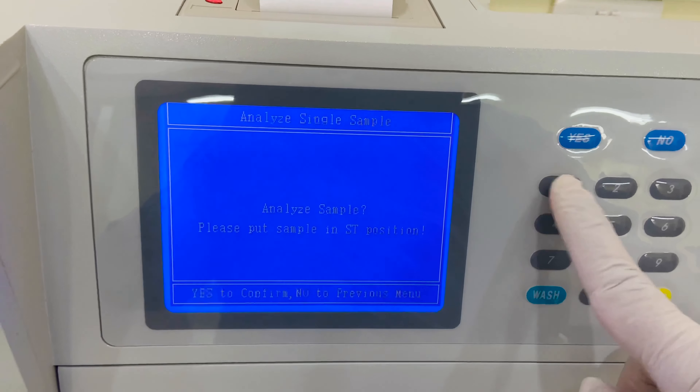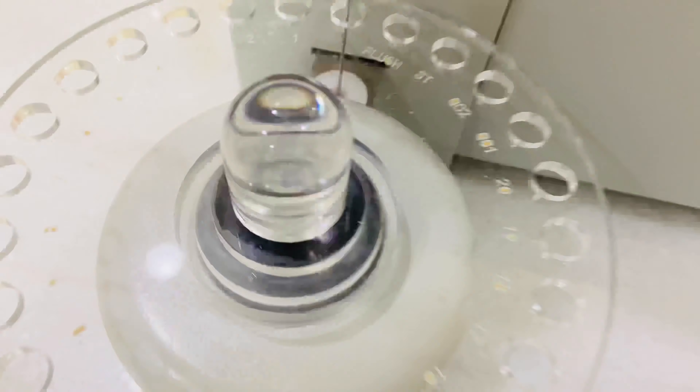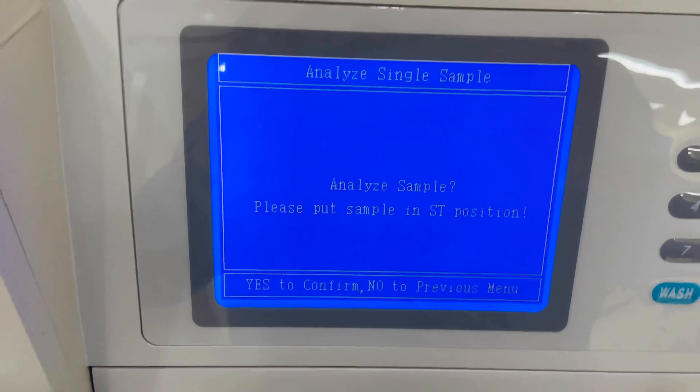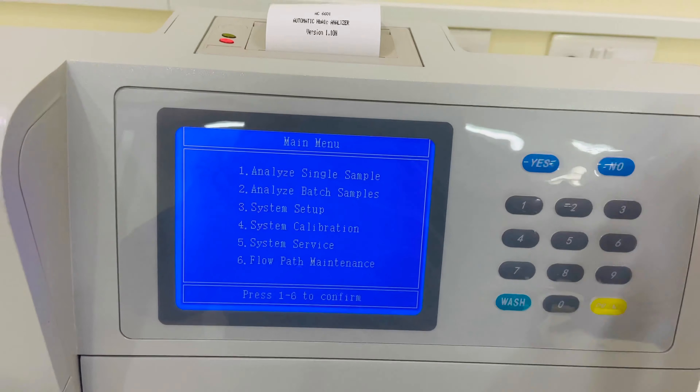In the software, option number one is 'Analyze Single Sample' — click it if you have only one sample. Option number two is for batch mode, if you have more than one sample.